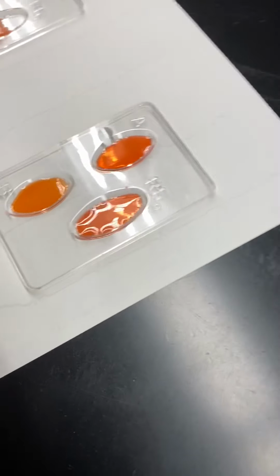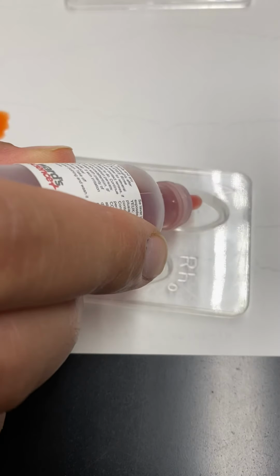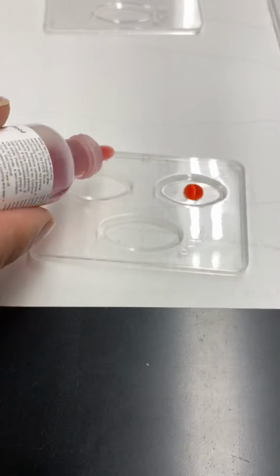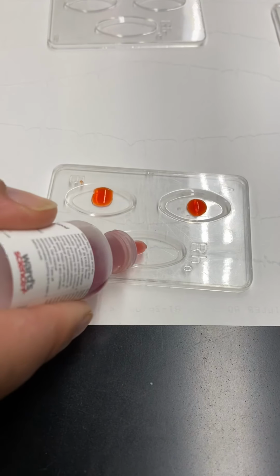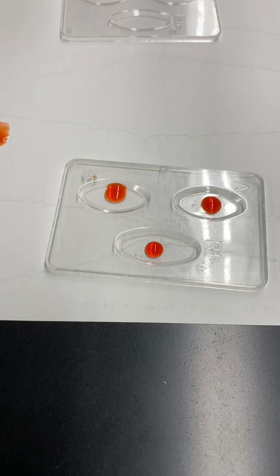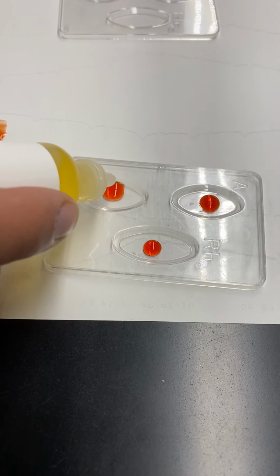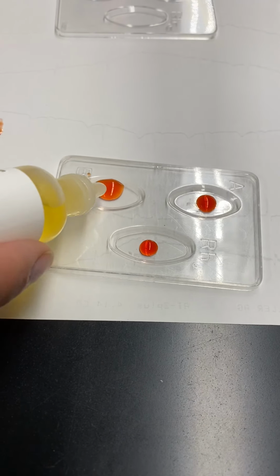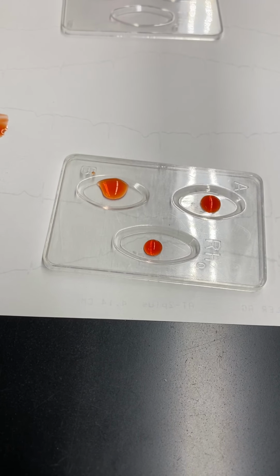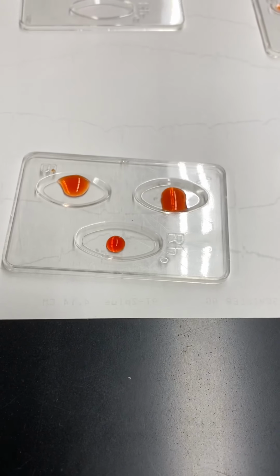So I'm going to repeat this again for the next sample, which is Mr. Jones. I guess there's bottle leakage in this bottle. And these are all fake samples of blood, so there is nothing in terms of transmitting any type of blood disease with it. So you don't have to worry about this if you were doing this in class or in person.